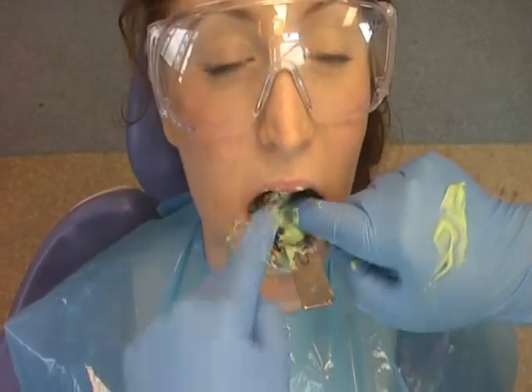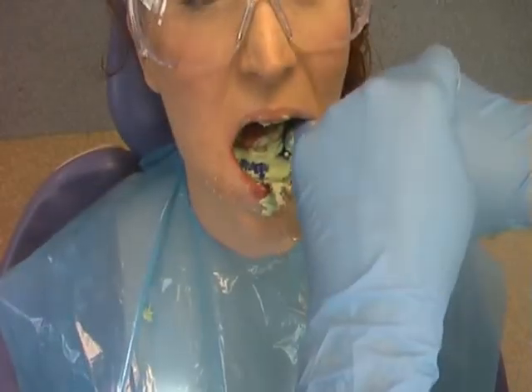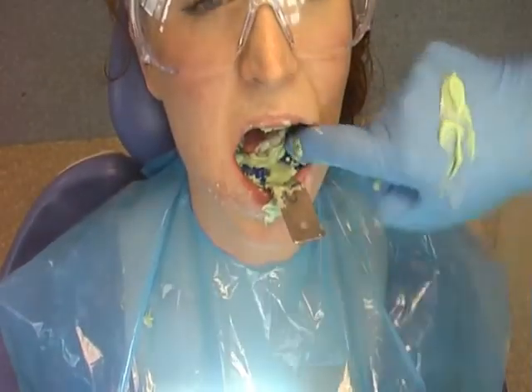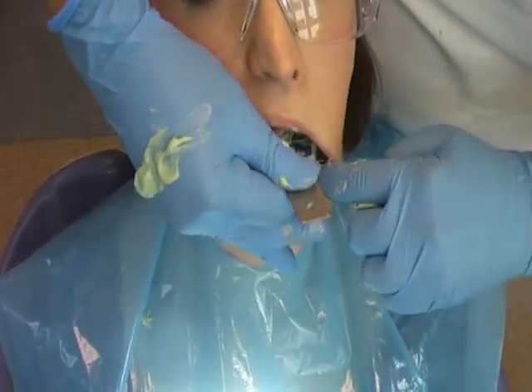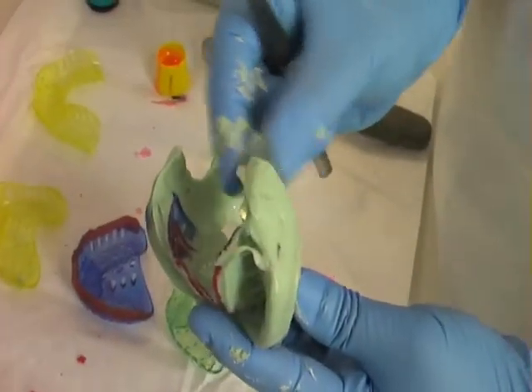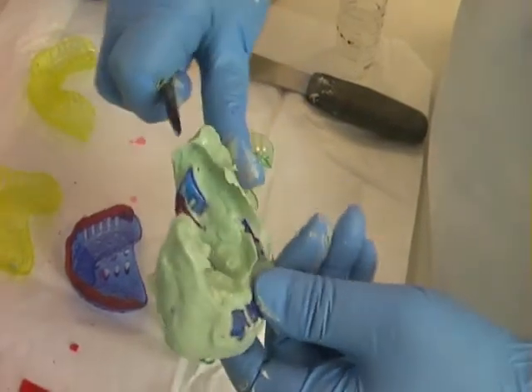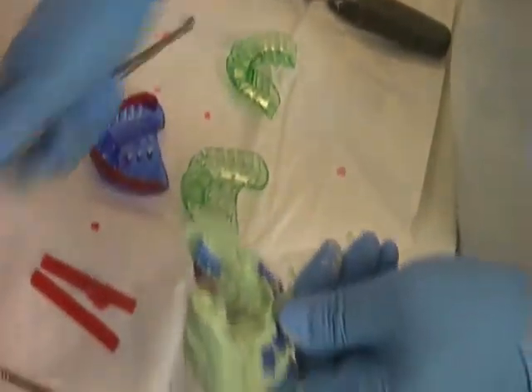It is very useful to retain some impression material on the back of your hand. When it is set it will show no print of your fingernail. When the alginate material has hardened you can remove the tray as it has now set. Any unsupported alginate should be removed; however be careful you don't remove any important areas of detail. If needed you can cut away any excess impression material.